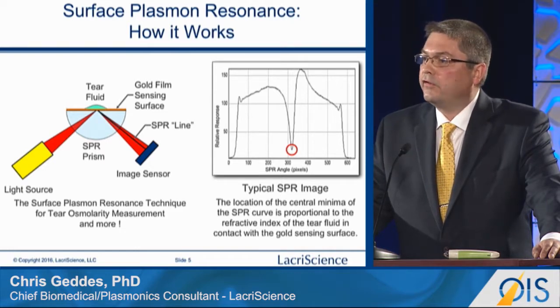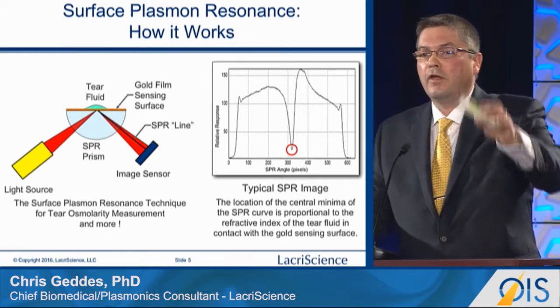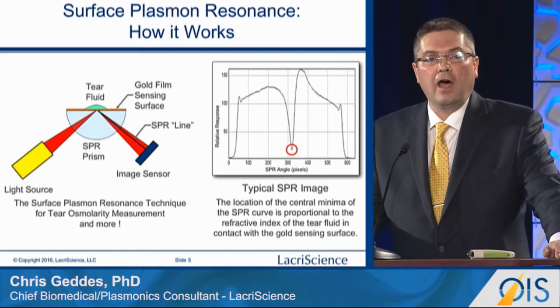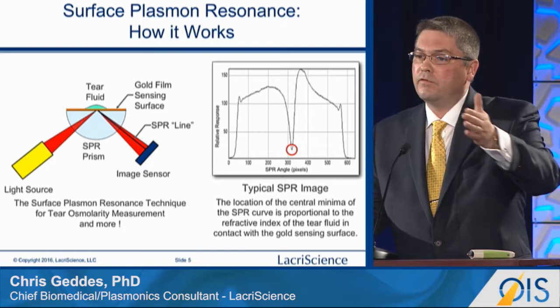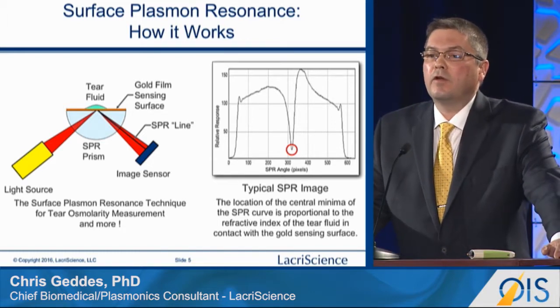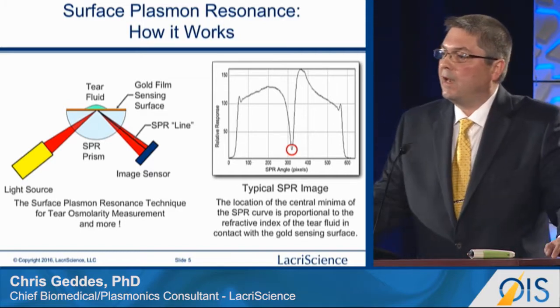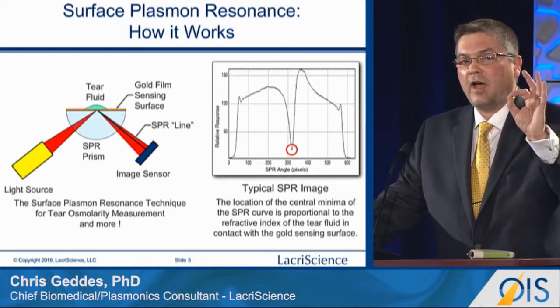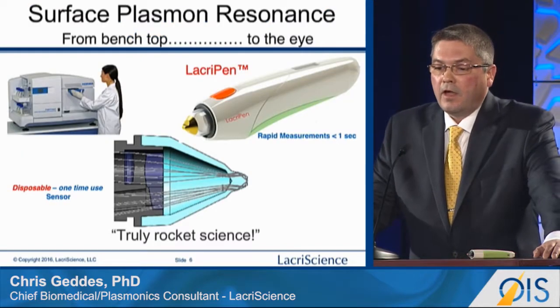Light sources fall incident on the underside of a very thin gold film that actually touches the surface of the eye. It forms an image line on a sensor, a little black line, which we call the reflectivity minimum, and this little black line actually moves. On the right-hand side, you can see a reflectivity minimum curve. That curve moves very minute amounts due to the tear osmolarity. And we've developed very complicated algorithms that can precisely determine where that reflectivity minimum is.